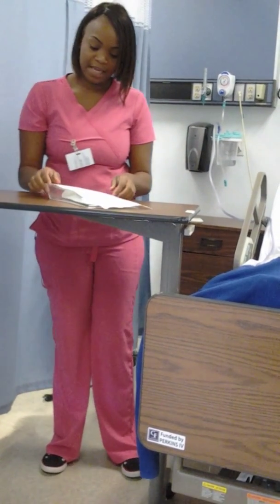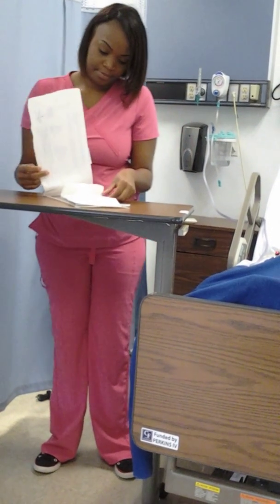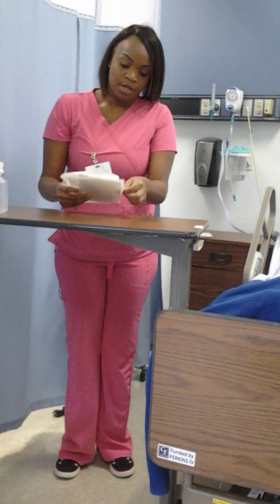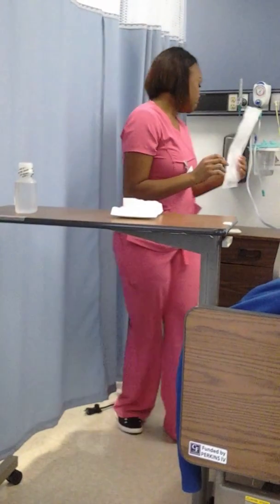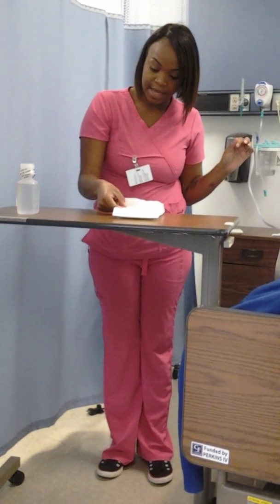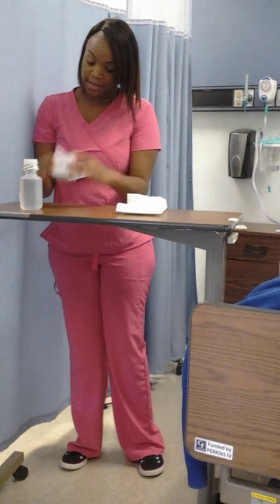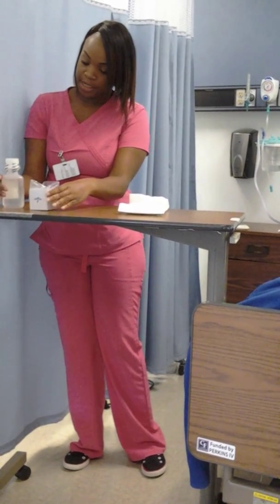I'm going to go ahead and open up my kit. Now before I open up the kit, I'll be sure to make sure that the table is clean and wiped and all of that stuff. Equipment is open. I'll trash this. I'm going to go ahead with my clean hands, take out the kit. I'm just going to squeeze the insides together. Now this is where I'm going to put my saline.